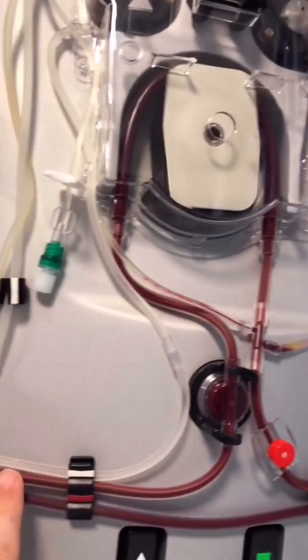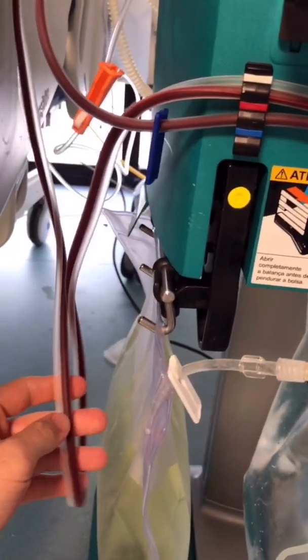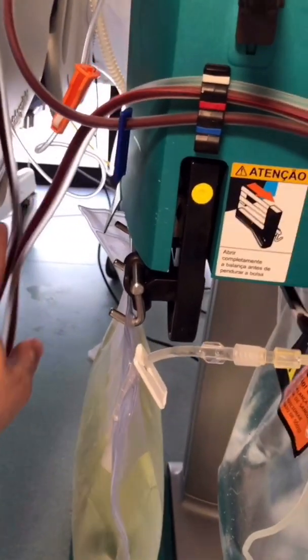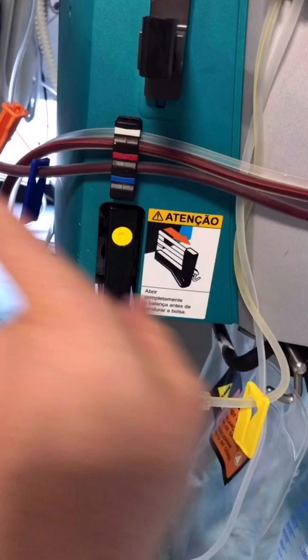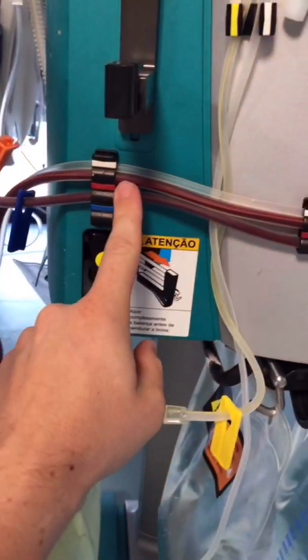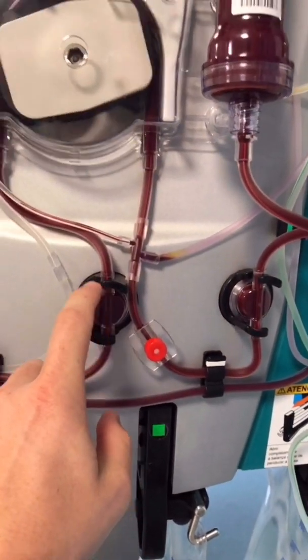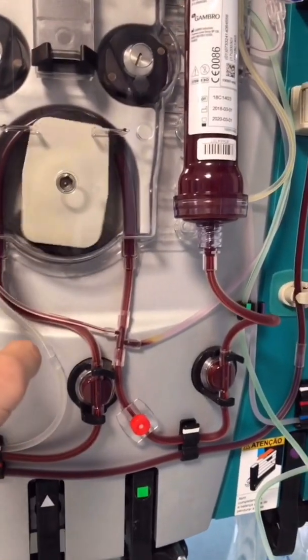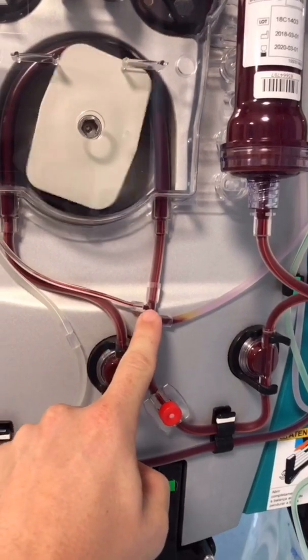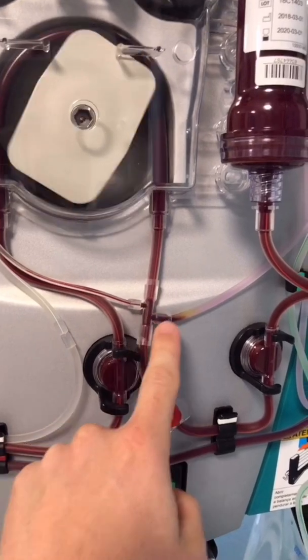The citrate meets the arterial line, but they are going in opposite directions — the blood is going in this direction and the citrate in the other direction, where it will get mixed with the blood. This is the arterial line with the pressure port, and it goes up to the blood pump.